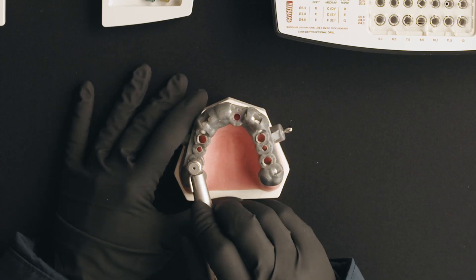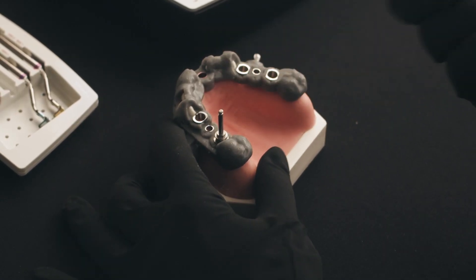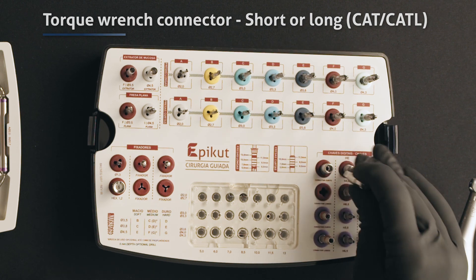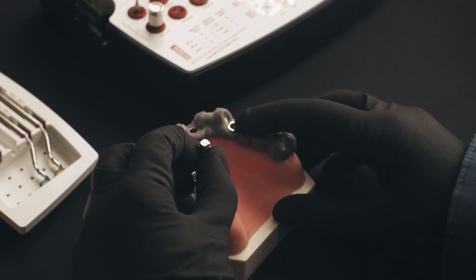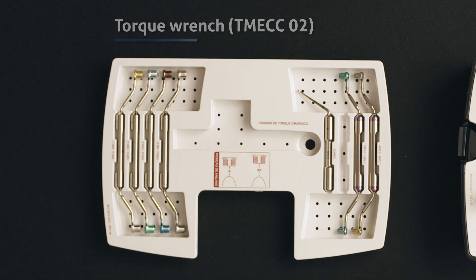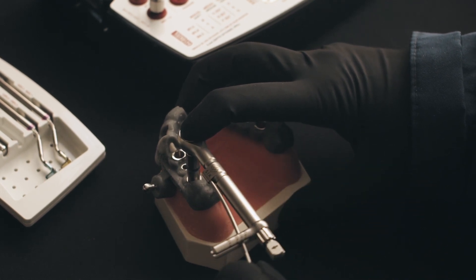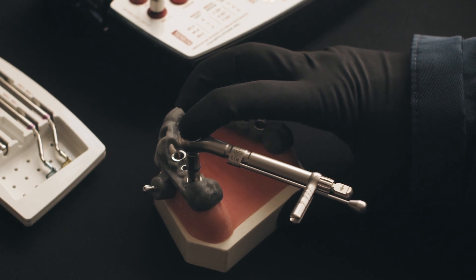Complete the implant placement with a surgical torque wrench. Remove the contra-angle head from the handpiece and change it to a surgical torque wrench with its connector, which can be either short or long. The implant placement is completed when the base of the wrench reaches the drill stopper of the guide.